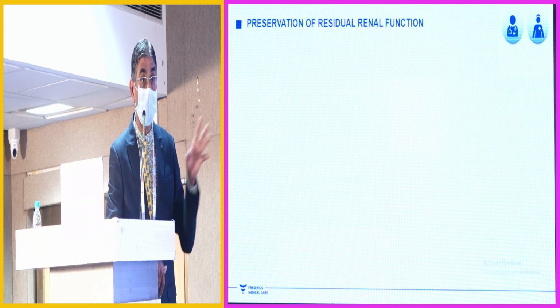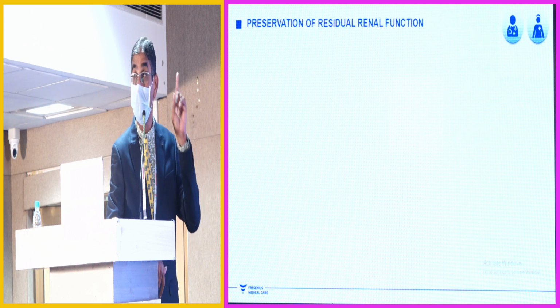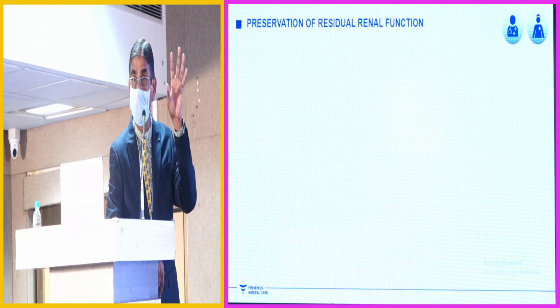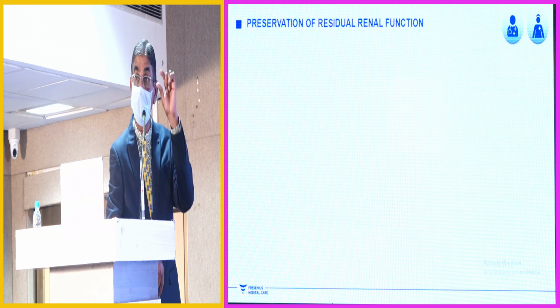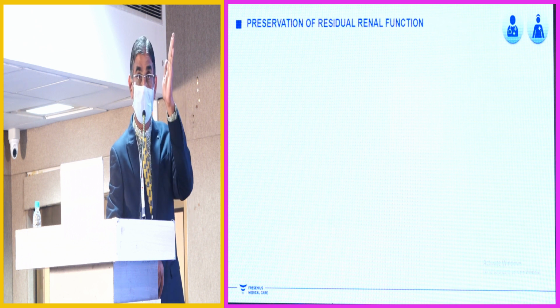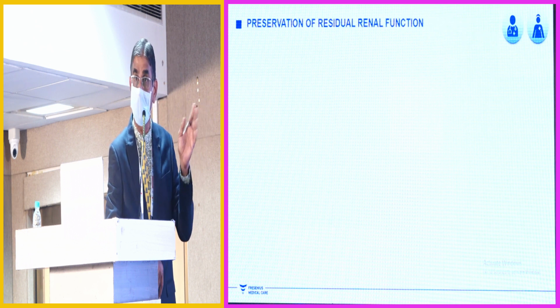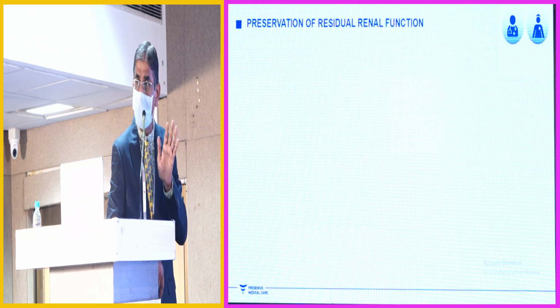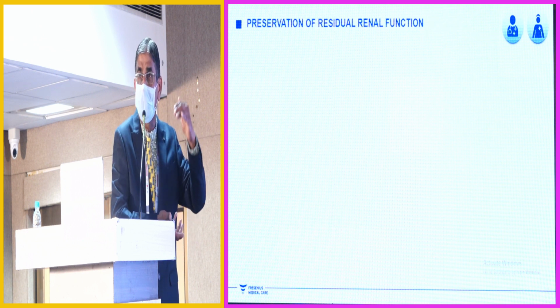It all depends on the timers. The RO system provider who has installed it in the hospital will give you a timer, so that after this many liters pass through the softener, it automatically goes to regeneration. The healthcare provider needs to only take care of the salt level.